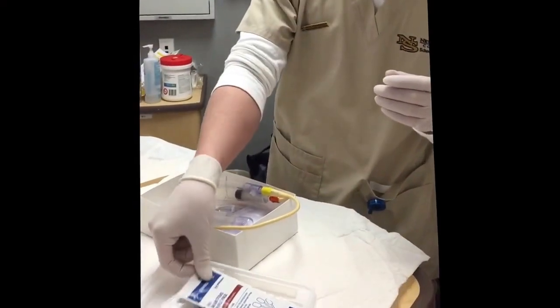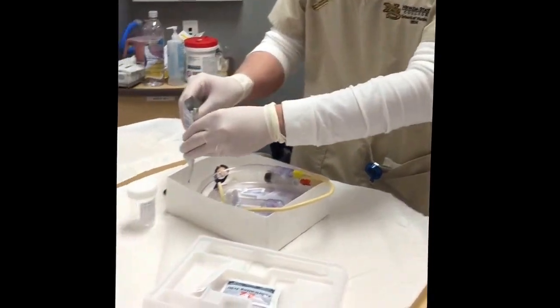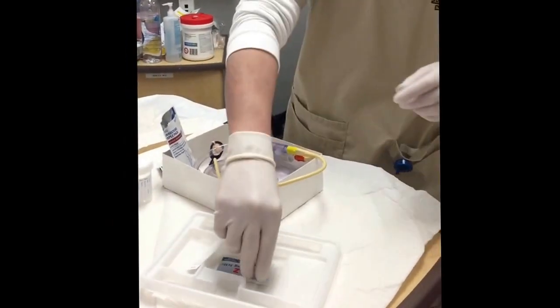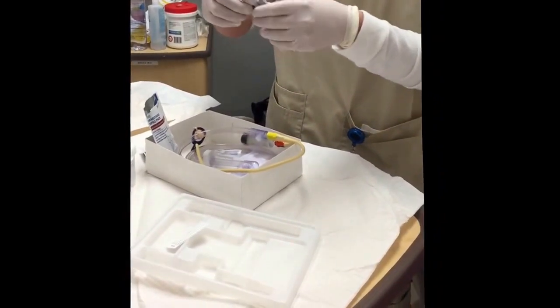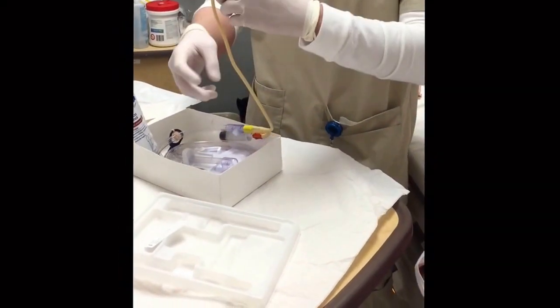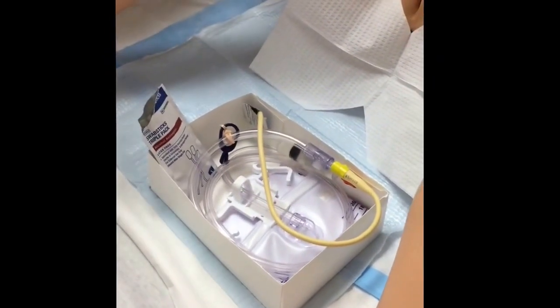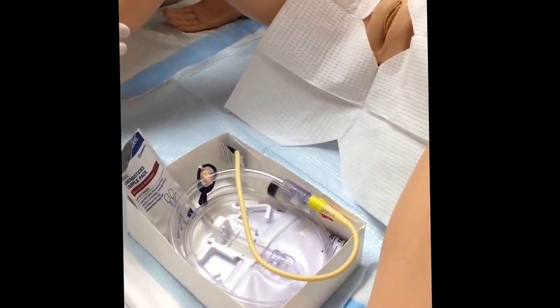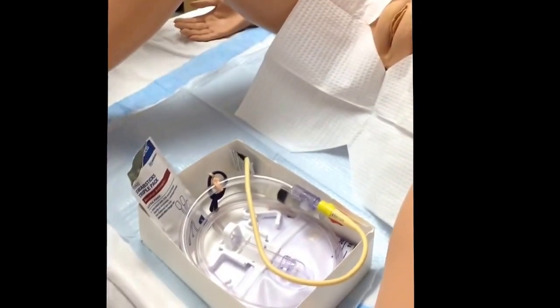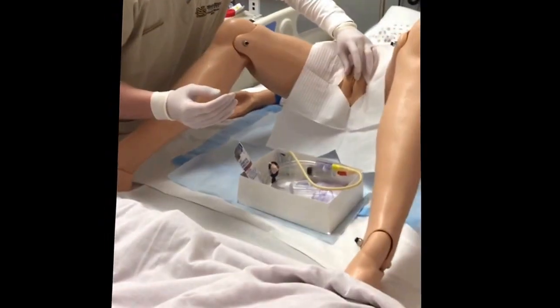So now, go ahead and prepare your items. Prepare this. Jane Smith, December 9th, 1990. Okay. And then what you can do here, we're just gonna take that out to avoid any mess, you can place this here, okay? First, we just get some gloves. That's good. So now you can bring this here without contaminating anything. Okay. So basically what I'm gonna do is remove this tape off of your leg. Miss Susan, it's gonna be a little cold once I put the iodine. And please let me know if you feel any pain or discomfort, okay? So make sure that you're holding this. Your non-dominant hand will be your non-sterile hand, and make sure that you're holding this part to keep it.